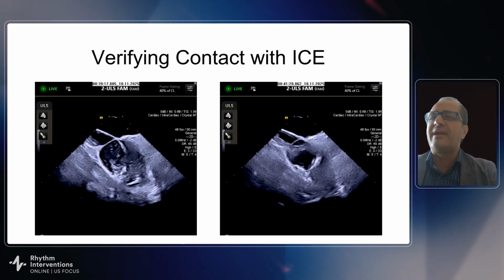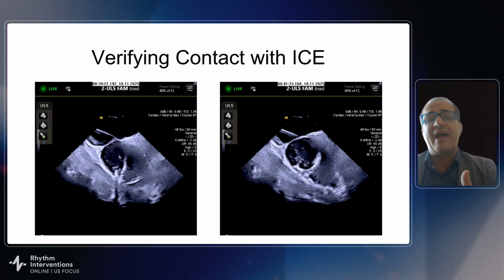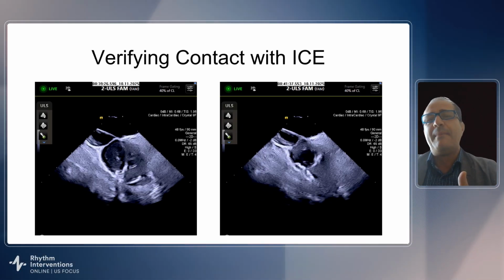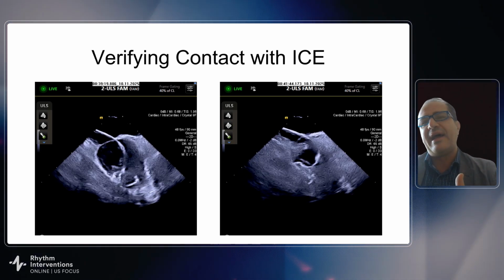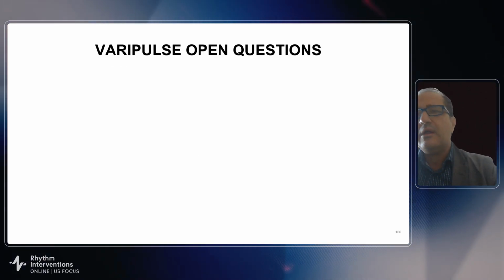Again, if you don't really like the TPI, or you want to double check, then you have integration with ultrasound that will not only give you the shell, but can show you a nice image of the contact. This is the crystal ICE with a higher number of crystals that allows for better visualization.